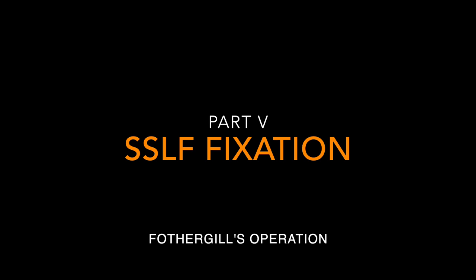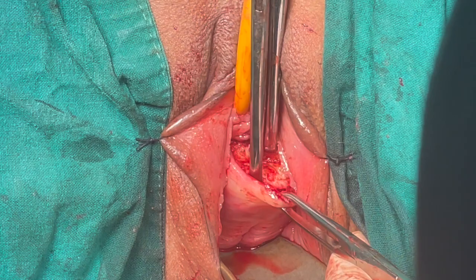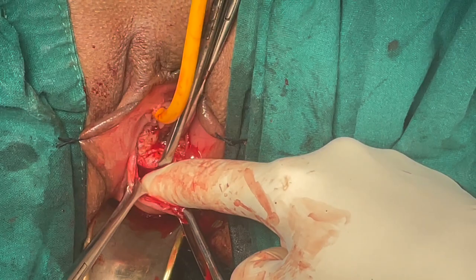As you have already seen in our earlier videos, cervical amputation has reduced the length of the cervix and Fothergill stitch has antiverted it. Now we are going to pull the uterus up with the help of sacrospinous ligament fixation.